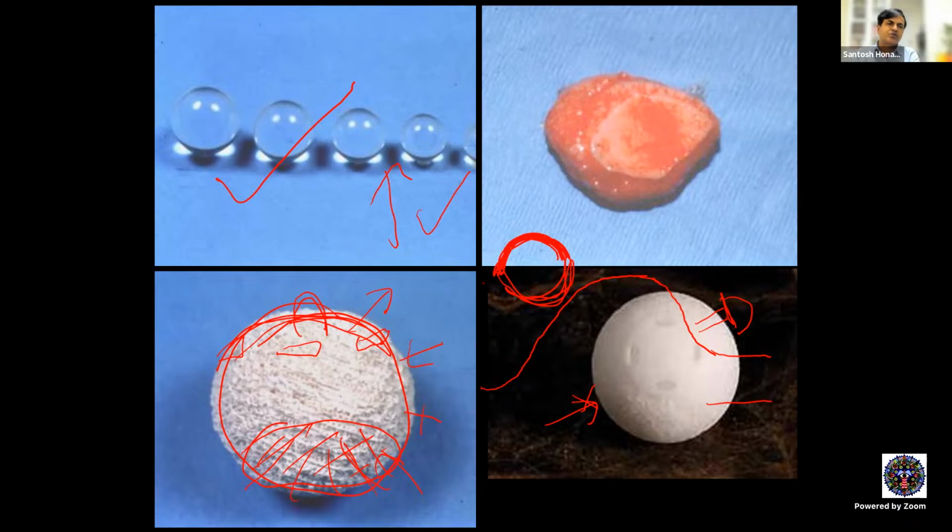That's because how else do you put the implant? These are rough surfaced implants. When you put it, the anterior tissue will be dragged along with it, right? So to ease the implantation, either you use an implant inserter or coat the posterior surface with a short-term coating to make the implant smoother, so there is no dragging of the tissue through the socket.